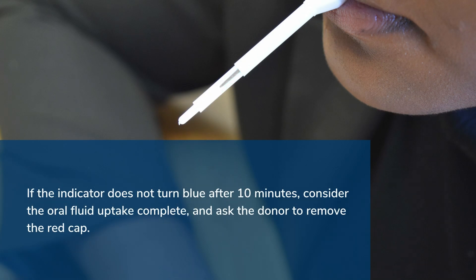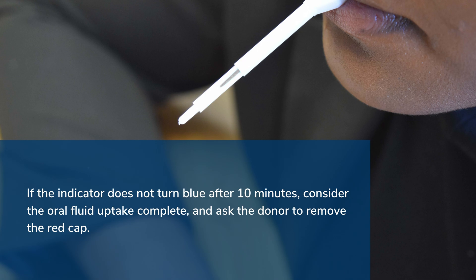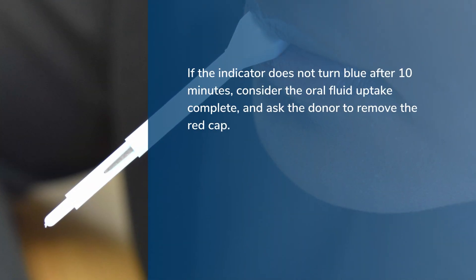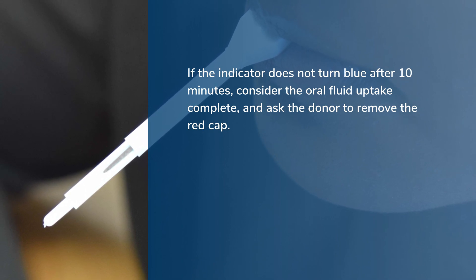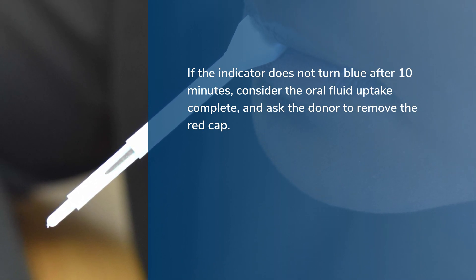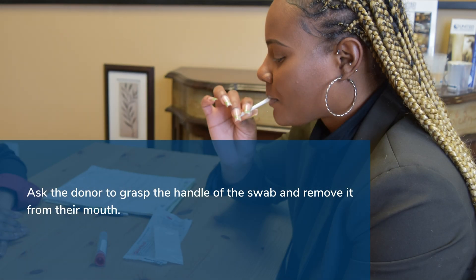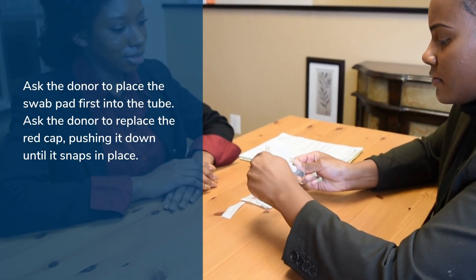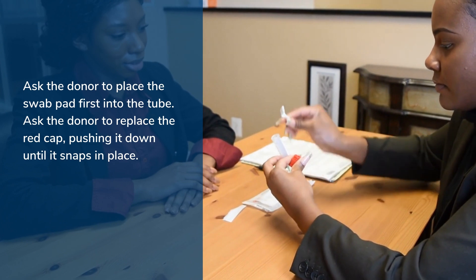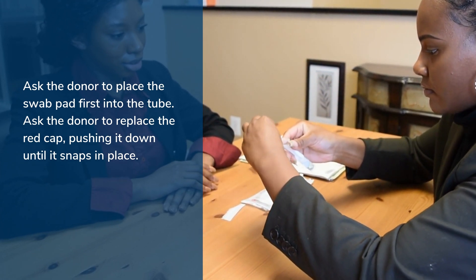If the indicator does not turn blue after 10 minutes, consider the oral fluid uptake complete and ask the donor to remove the red cap. Ask the donor to grasp the handle of the swab and remove it from his or her mouth. Ask the donor to place the swab pad first into the tube. Ask the donor to replace the red cap, pushing it down until it snaps into place.